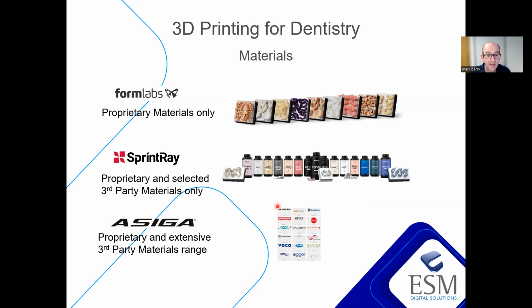Asiga have their own range of materials. And pretty much every 3D printing material out there for dentistry work, I'd say 90, 95% of materials, can be used on an Asiga printer. So Asiga's business strategy is: let's make a great printer, be as open as possible, and let people who make materials validate their materials on our printer.